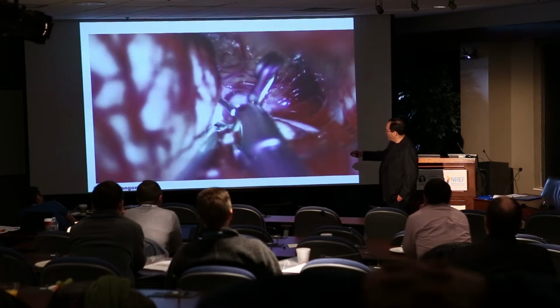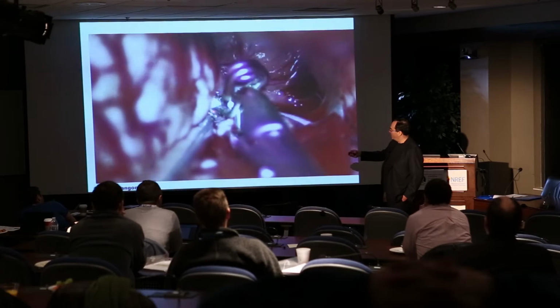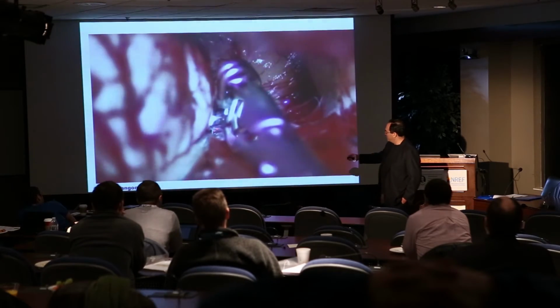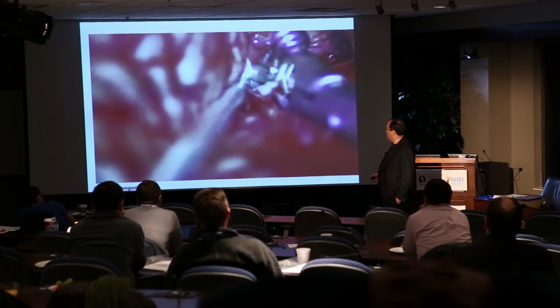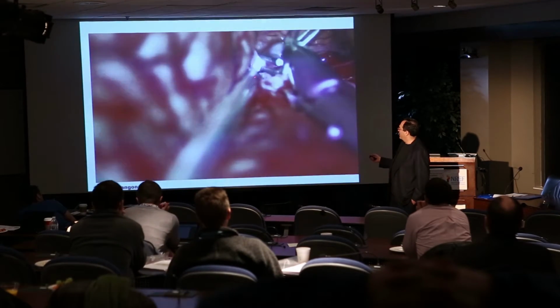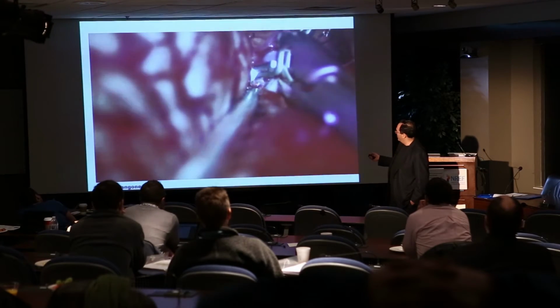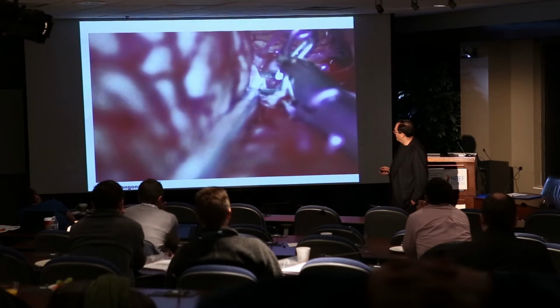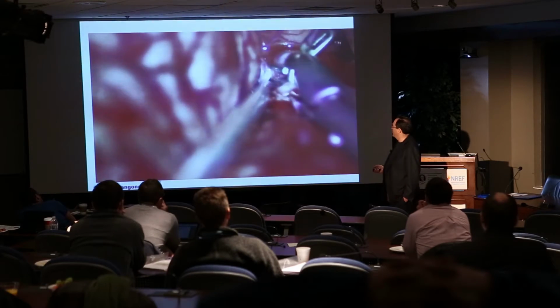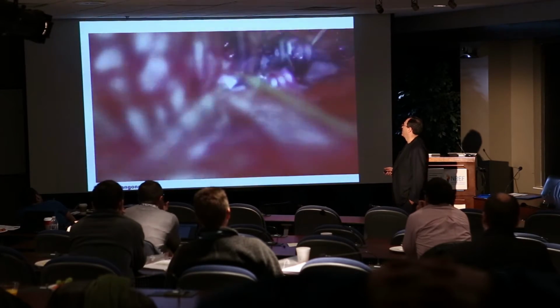Now this aneurysm is arising between that pericallosal that's arising from the complex and not the other A2. And so what you're seeing underneath, you're going to see in a second when I look underneath, is that pericallosal, and the clip isn't completely across. By examining the position of the clip, you can see there's still some aneurysm there. And so you have to advance the clip a little bit. And again, still draining CSF in there.